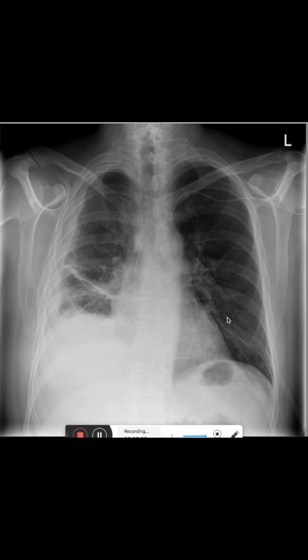In this chest X-ray, we see a patient that has a homogenous consolidation in the right lower field. We also see that it has this typical meniscus shape, so we can assume that this is a one-sided pleural effusion.